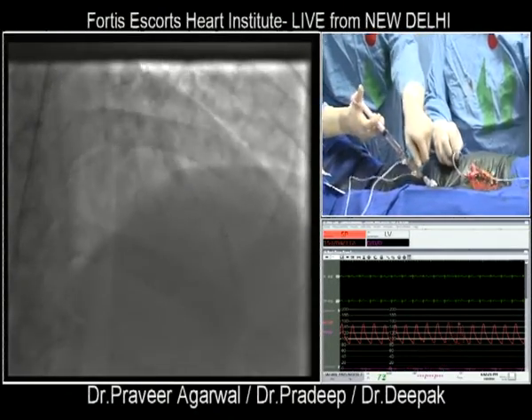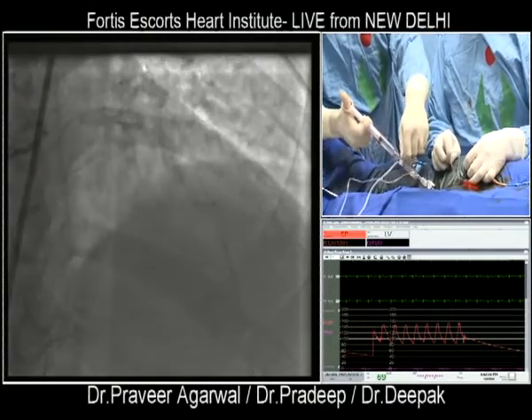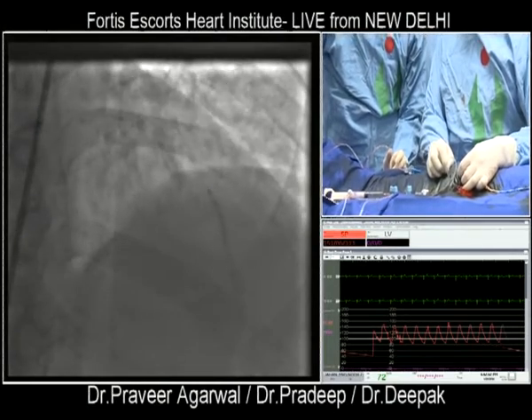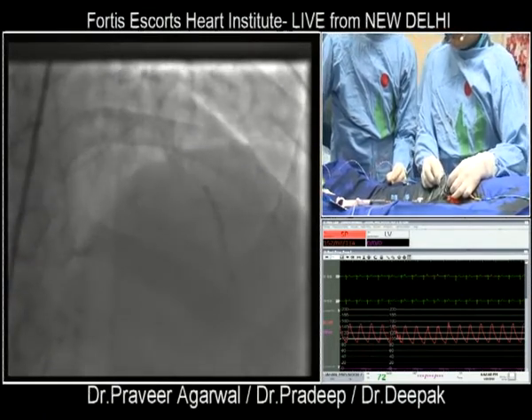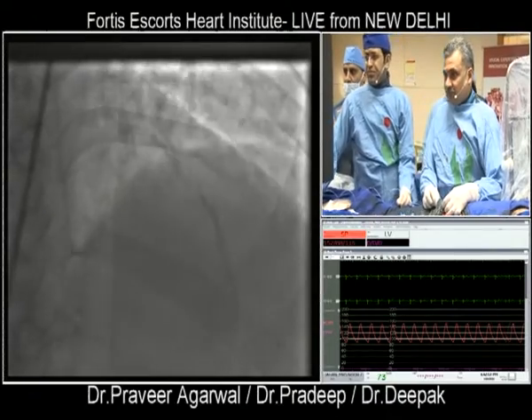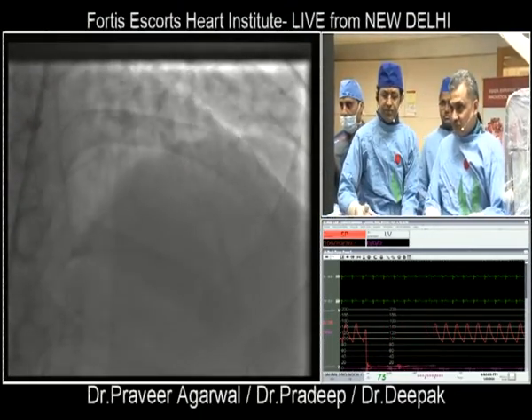Okay. Can I have a small check, please? Okay, yeah. He wants to check the position of the balloon. 2, 2.5, 3, 3.5, 4, 4.5, 5, 5.5, 6, 6.5, 7, 7.5, 8, 8.5, 9. Deflate. Just a small check.